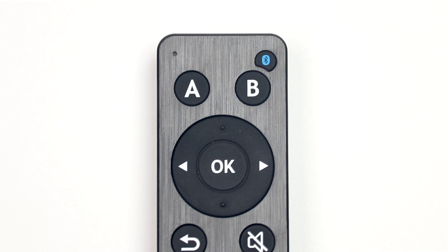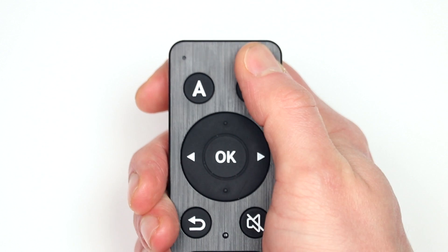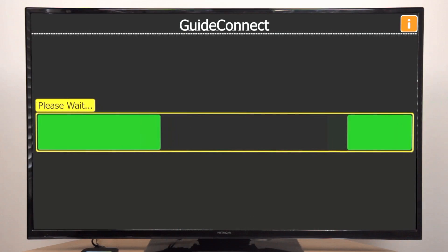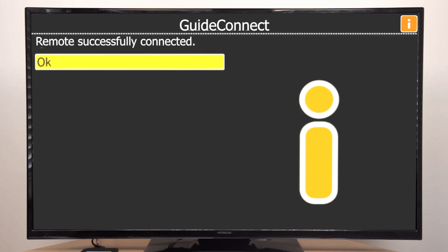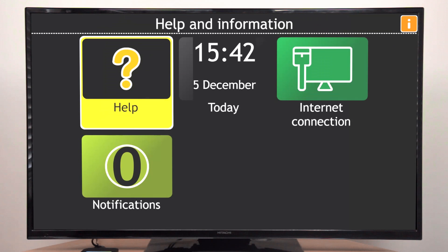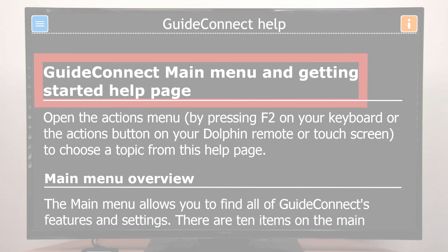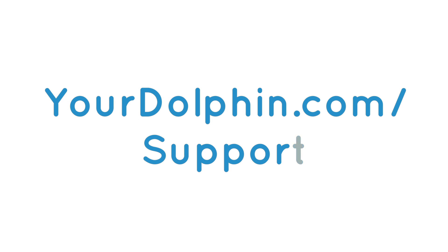Finally, the small button at the very top right is the Pairing button. You will only need this button when you connect a new Dolphin remote to GuideConnect. We hope you enjoy using GuideConnect. And remember, if you need help at any time, visit us online at yourdolphin.com/support or contact your local dealer.